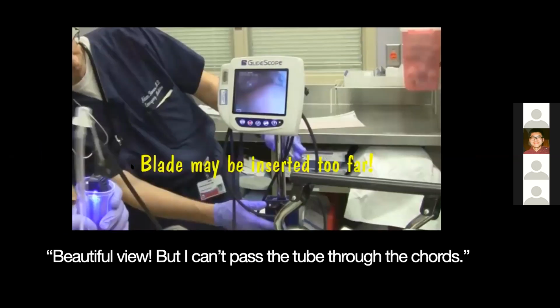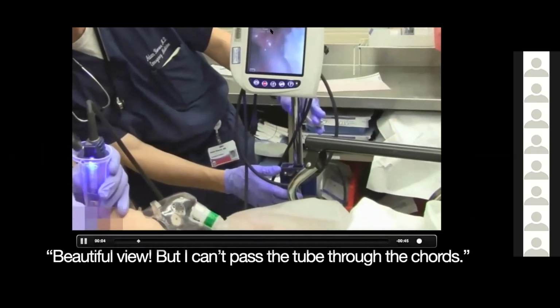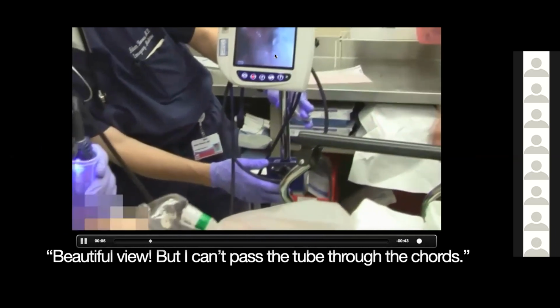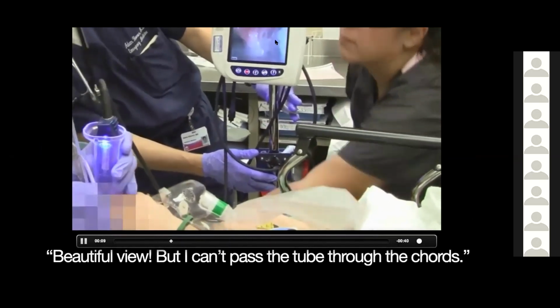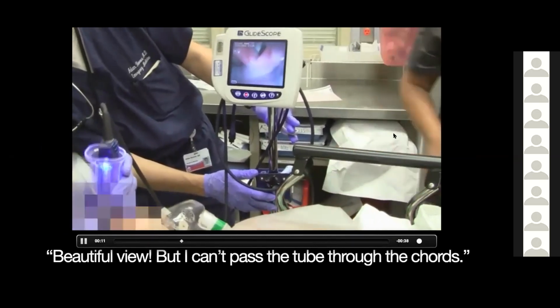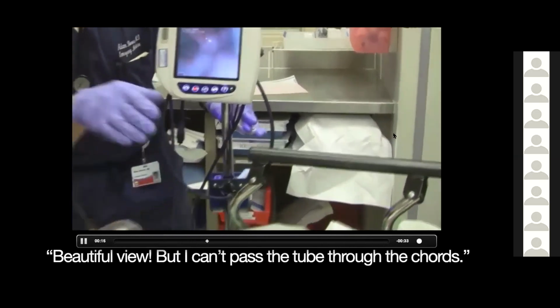Pitfall number 2. Let's have a look at that short video again. So again, you have that great view, right? We see the nice cords, but look at this. Your tube keeps hitting the arytenoids, so you're not able to put it through the cords. And honestly, be honest, guys, that's the most common thing we encounter.